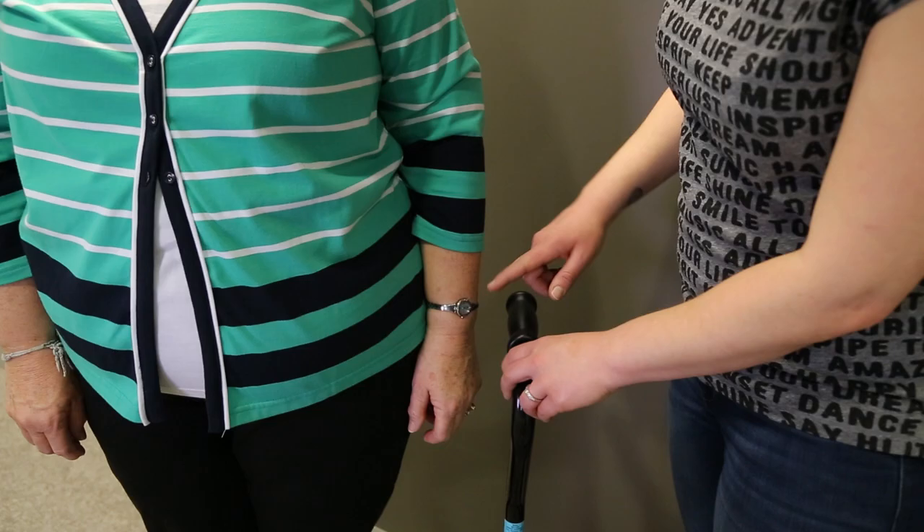Hello, this is a walking stick training video suitable for clinicians and people with knee osteoarthritis. For the purpose of this training video today, we've got a patient with right knee osteoarthritis, so we're going to be looking to use a walking stick in the left hand.